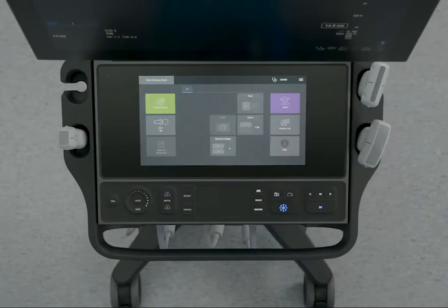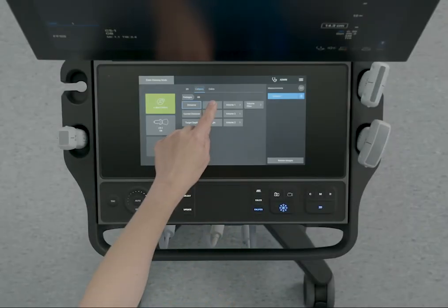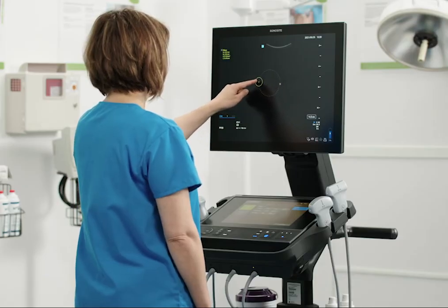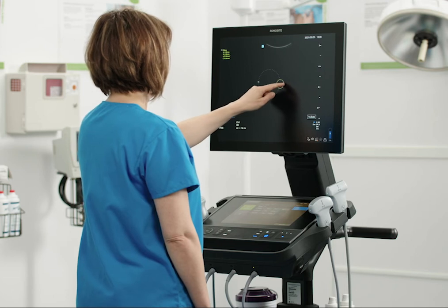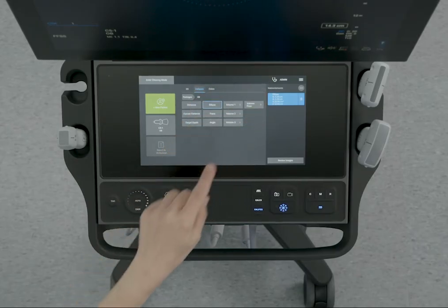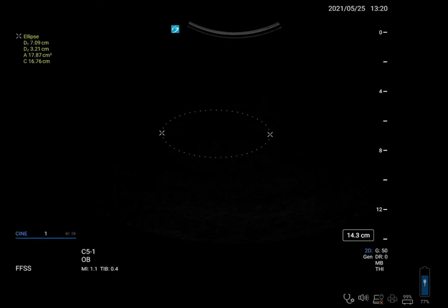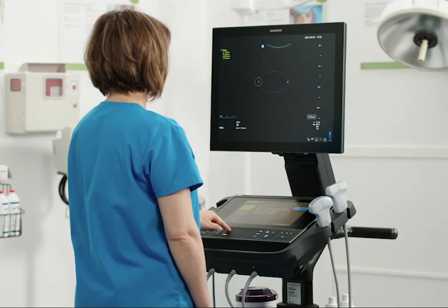To measure circumference and surface area, tap the ellipse measurement. Position the first caliper with the touchpad or monitor touch screen. Then press select or tap the second caliper to position it. Pressing select again allows you to reshape the ellipse. Keep pressing select or tap on the monitor to toggle between positioning the calipers and shaping the ellipse.